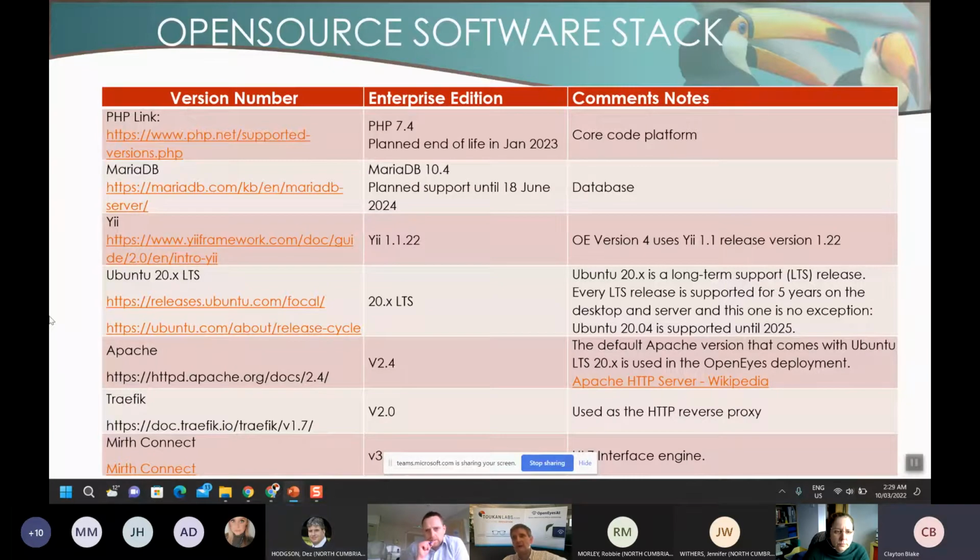That gets into ways of working as part of the support release and everything. There are security patches which are applied as mandated, so they come in. However, if there are other patches or versions, you're notified about the patch or version before it comes out, so that you've got time to decide whether you want to do that.